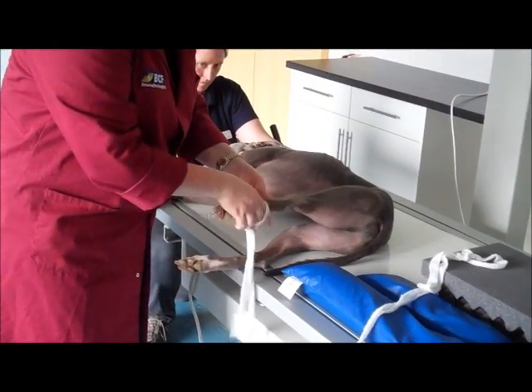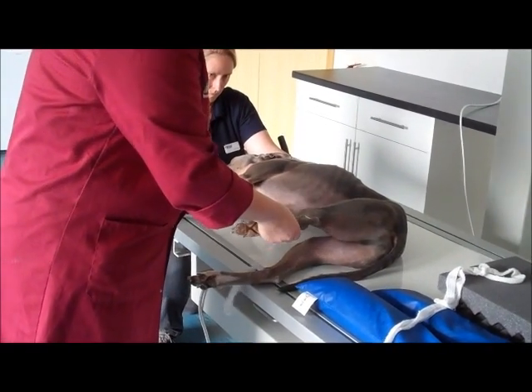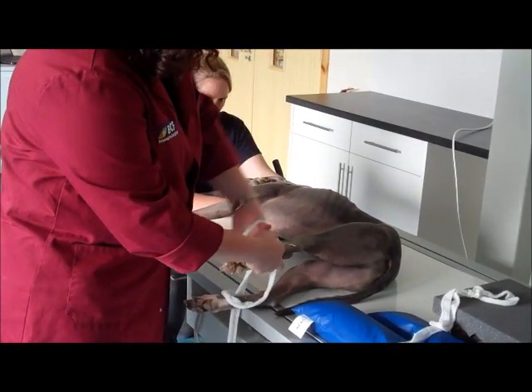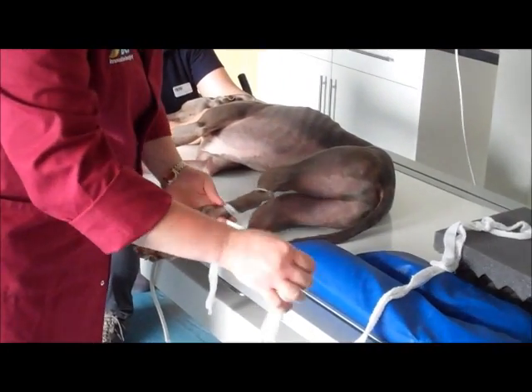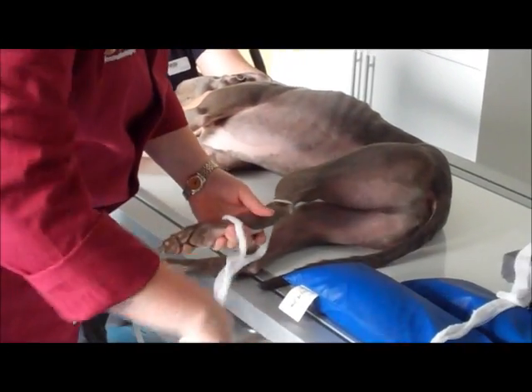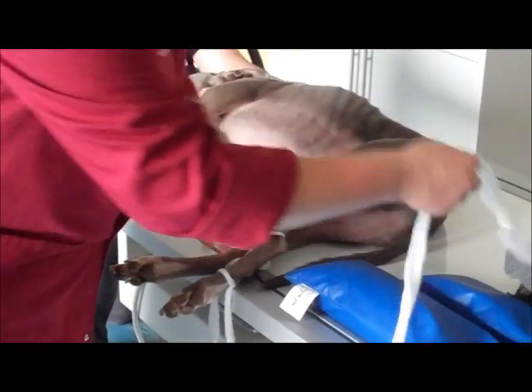I tend to put this so that you're not putting excess pressure on any one point — above the level of the hock — tighten it but not too much, and then make a loop with the remainder and place that halfway down the metatarsals. I'll do that with the other leg as well.